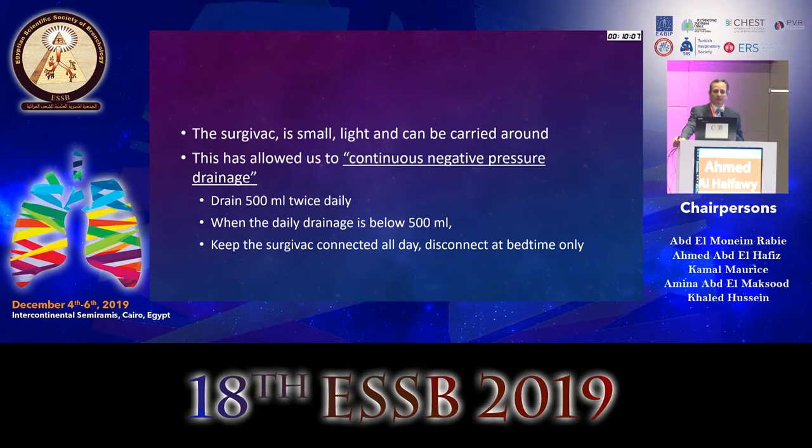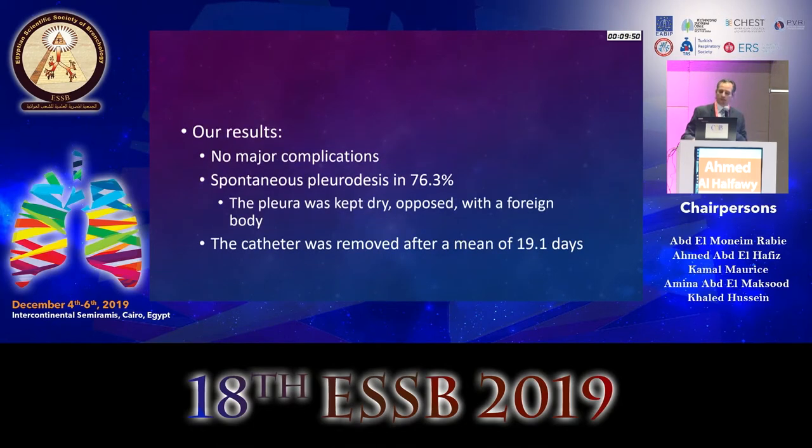And when the daily drainage is less than 500 milliliters, less than the content of one SurgiVac container, I asked the patients to keep it connected all day, only removing it when they go to sleep. And we had no major complications with this.